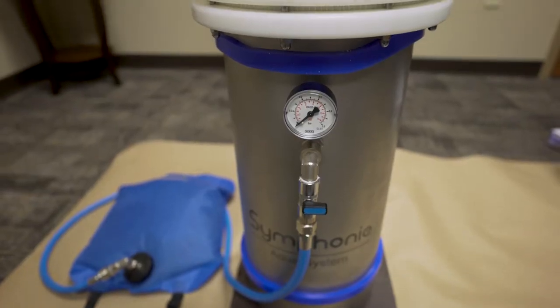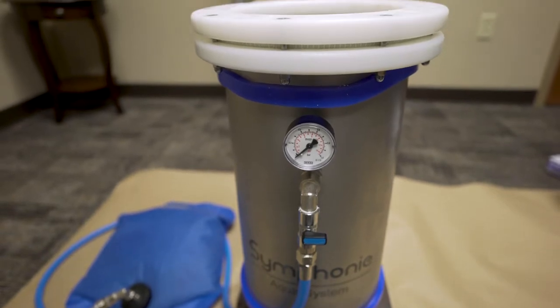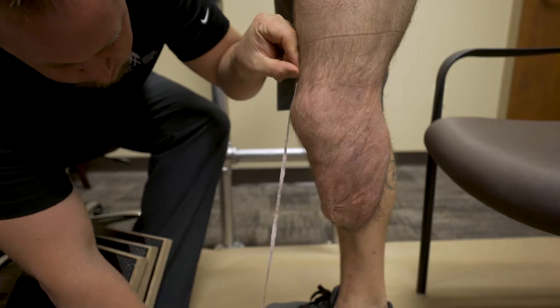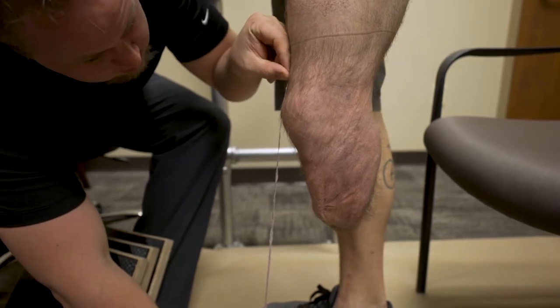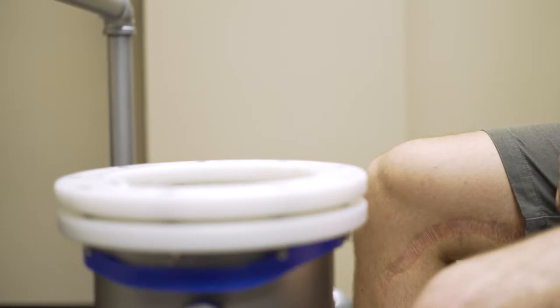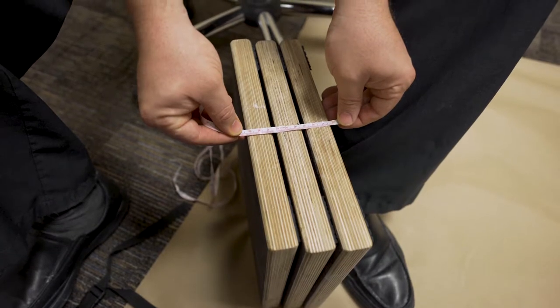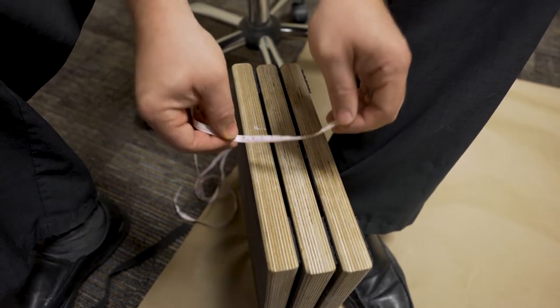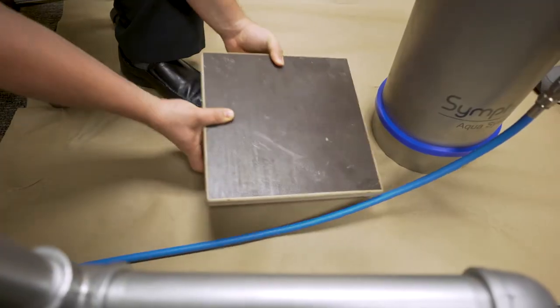Now that the Symphony Aqua system is fully lubricated on the inside membrane, it is time to determine the proper height of the tank in relationship to the patient. Have the patient sit — the top of the tank should be level or slightly above the patient's sound side knee in the seated position. If shims are needed, place the correct number underneath the tank to achieve the desired height.